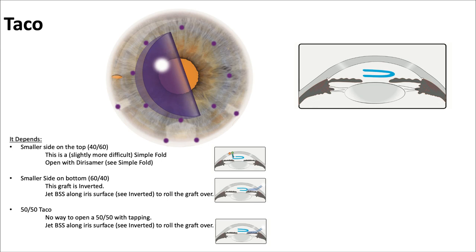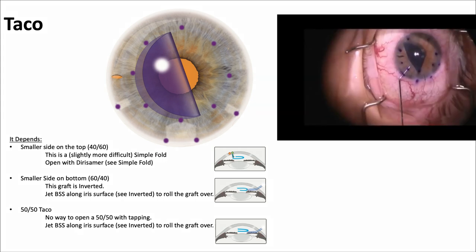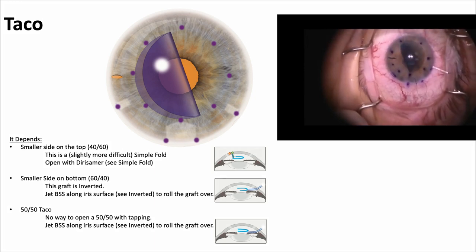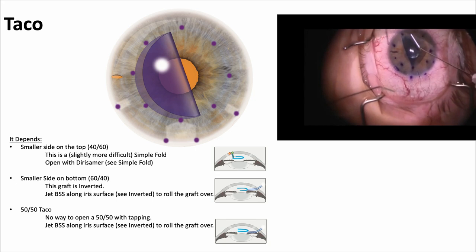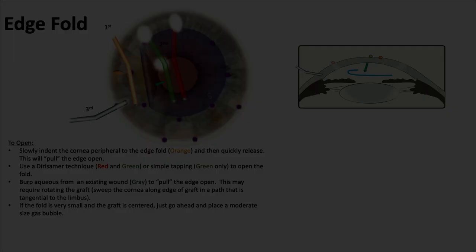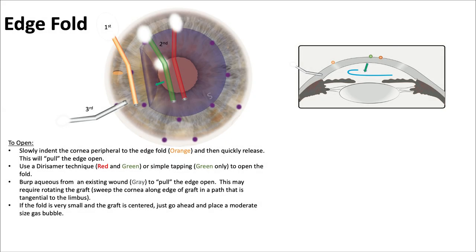The taco — it depends. If the smaller side is on top, it's slightly more difficult; start with the Derisamer technique. If the smaller side is on the bottom, the graft may be inverted, so jet some BSS along it. A 50-50 taco is very difficult to open. There's the taco formation — sending a little fluid wave across, then tapping it gently, then getting it to open up using the Derisamer technique, and it unrolls.